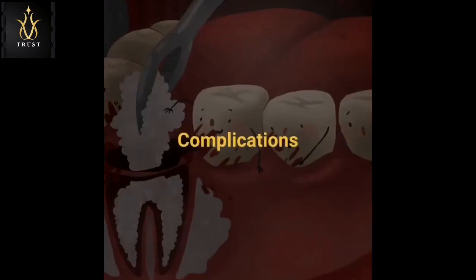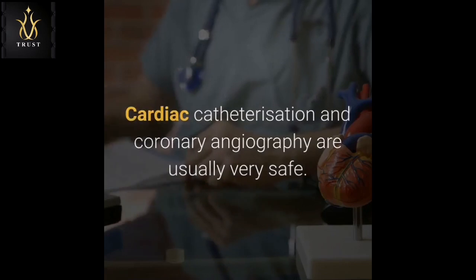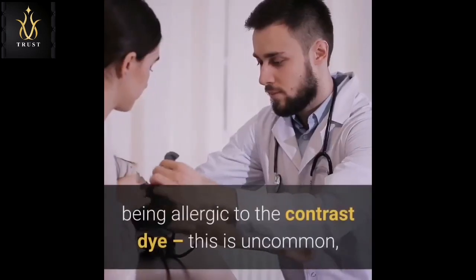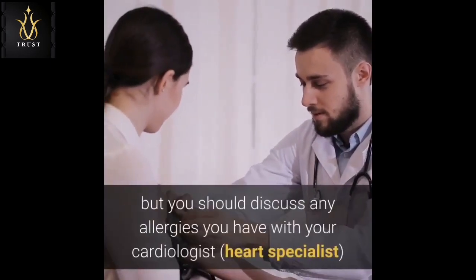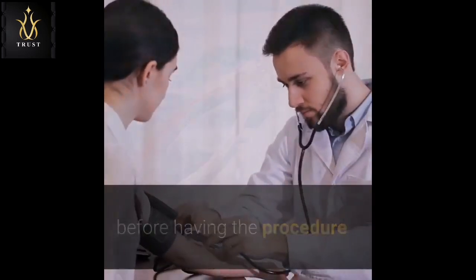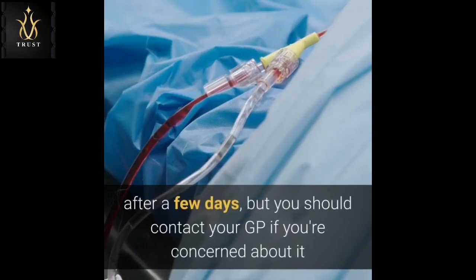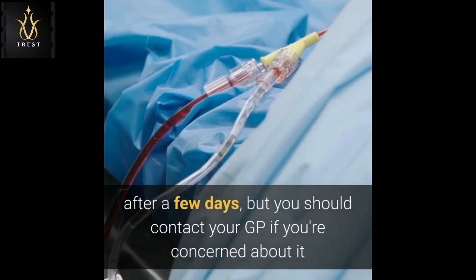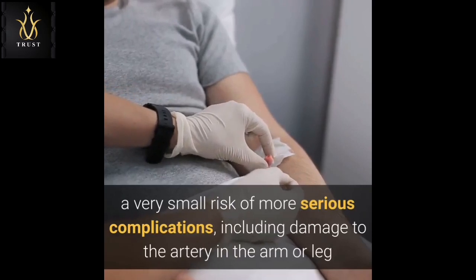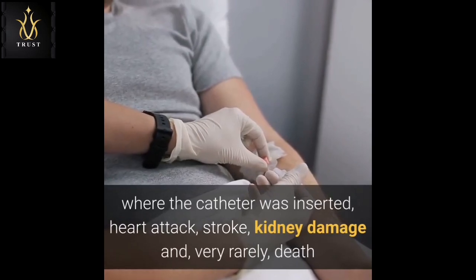Complications: cardiac catheterization and coronary angiography are usually very safe, but as with all procedures there are some risks, including being allergic to the contrast dye — this is uncommon, but you should discuss any allergies with your cardiologist before the procedure — bleeding under the skin where the catheter was inserted, which should stop after a few days. There is also a very small risk of more serious complications including damage to the artery in the arm or leg where the catheter was inserted, heart attack, stroke, kidney damage, and very rarely, death.